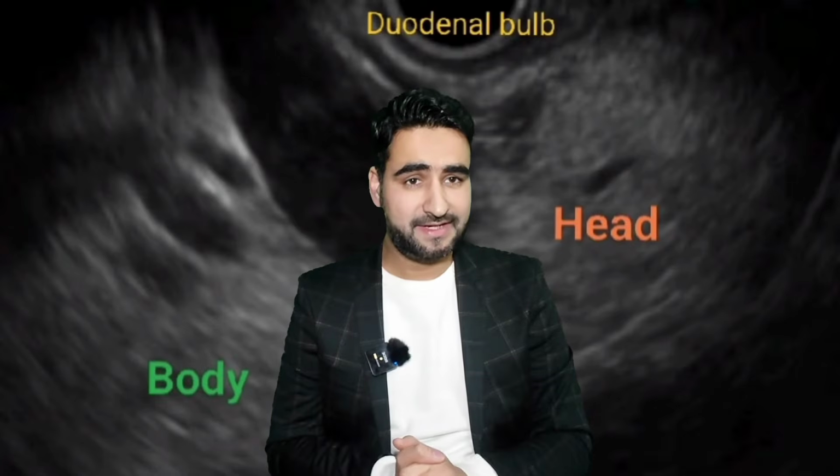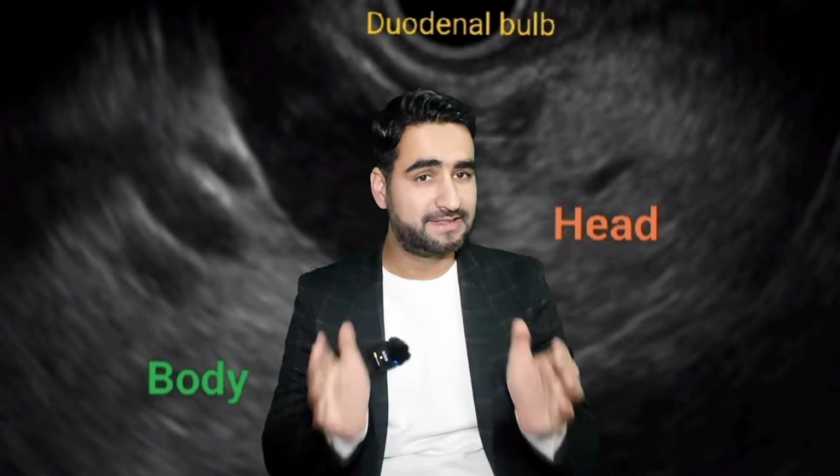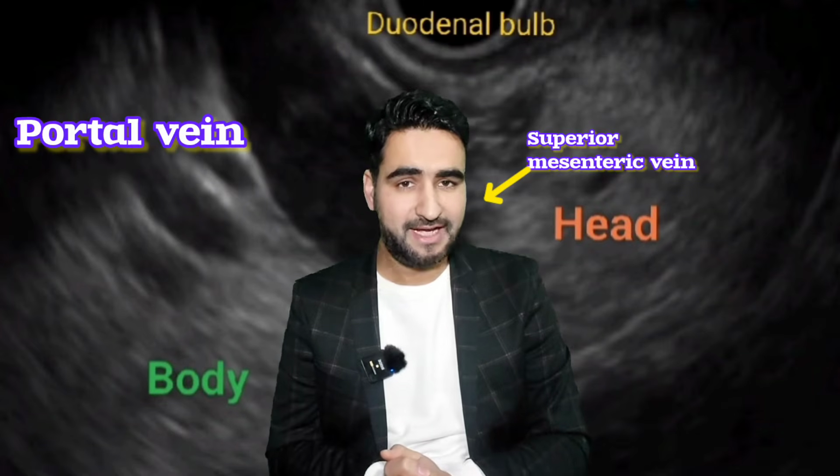Why does the head of pancreas appear on the right side of the endoscopic ultrasound image while the body appears on the left? Why is the portal vein on the left while the superior mesenteric vein is on the right? Why does the splenic vein appear to enter the portal vein from the left side of the screen? Why is the papilla seen on the right side of the endoscopic ultrasound image? What exactly happens to your image when you perform clockwise versus counterclockwise sweeps at the station? Let us unravel this mystery together.